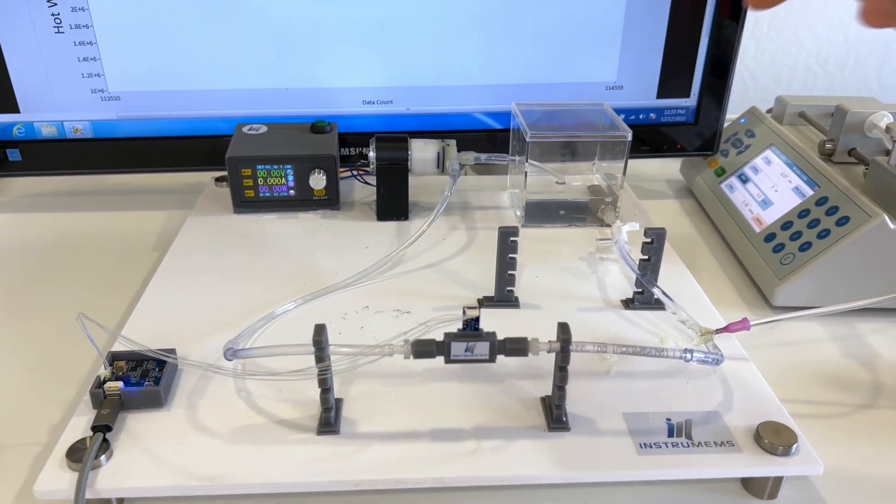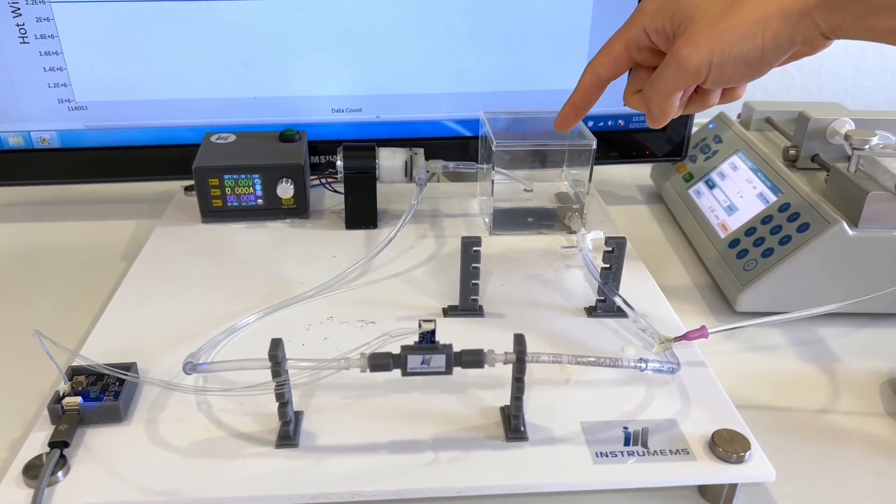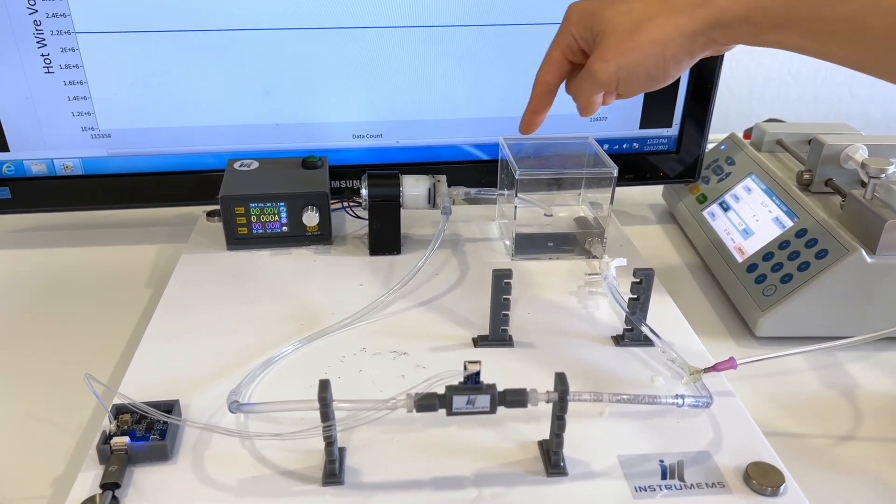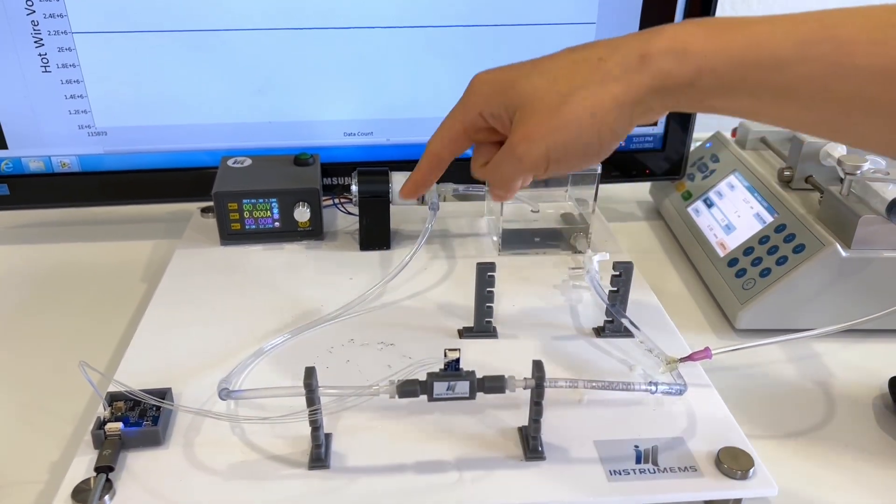To generate a smooth flow profile and reduce any noise from the pump, the liquid is housed in this reservoir. A water pump is used to generate the flow for the sensor under test.